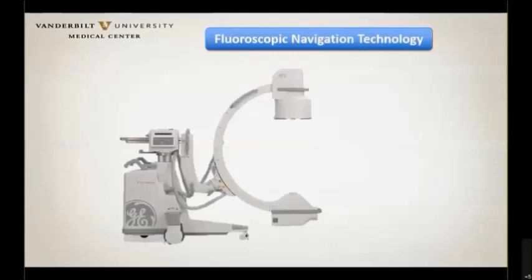We've been doing a lot of cone beam CT here at Vandy. We actually stopped during the COVID pandemic. But really, we're using cone beam as a confirmation tool. I know Krish and some people have a lot of experience with it. I'm still having a little bit of a hard time understanding how to readjust my trajectory to get my biopsies. And obviously, cone beam CT is not usually accessible for a lot of folks. So we get 1 half day a week of cone beam CT for 3 interventional pulmonologists here at Vanderbilt. And this is pretty much what's happening across the country at large tertiary centers, except for a few lucky ones among us.